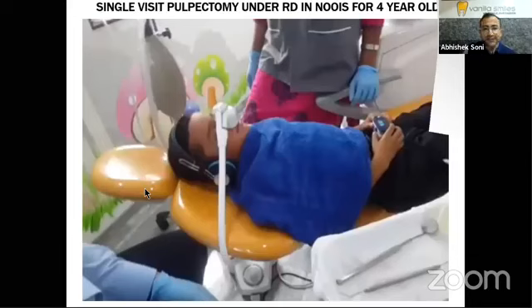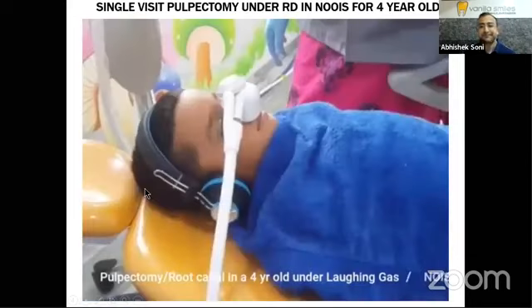So let's look at a single visit pulpectomy and the workflow for the same.